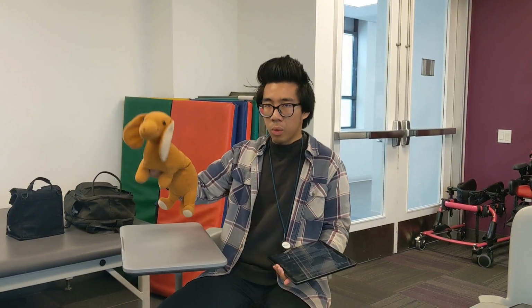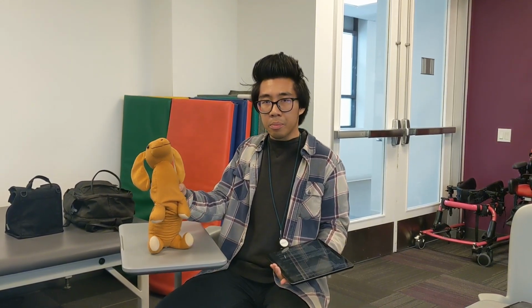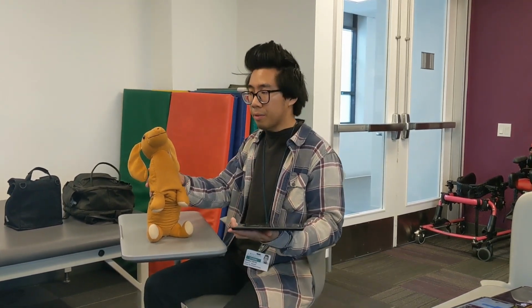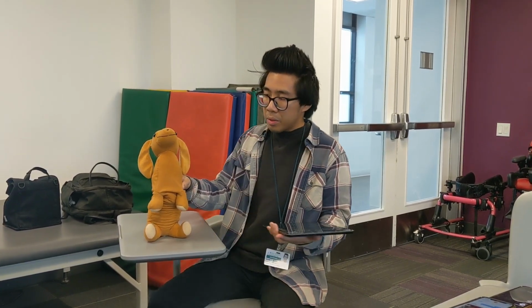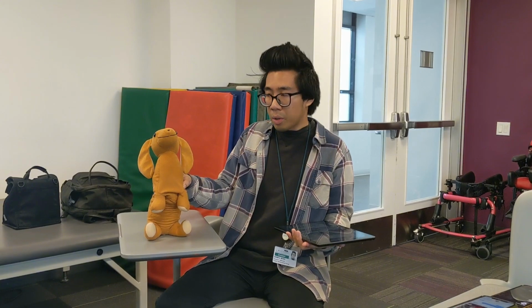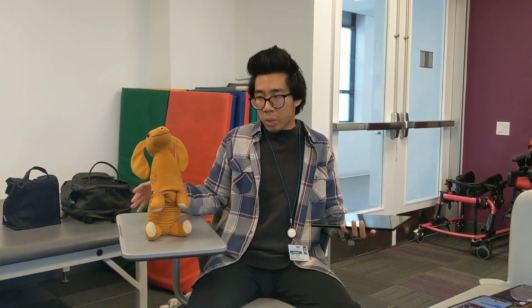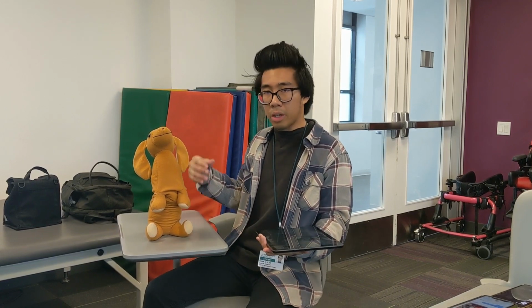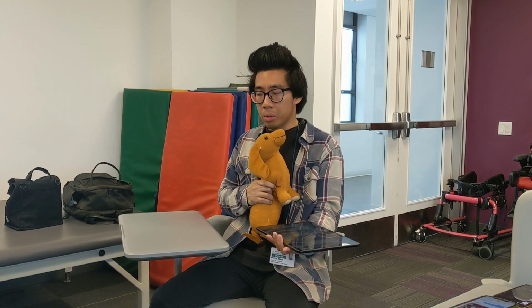This is a weighted toy. The primary purpose of this is to provide that proprioceptive input for children, which can modulate the central nervous system, inducing a calming effect on the child. It makes the child feel more grounded and it lowers their state of arousal. This can be used to improve their concentration, their focus, and their attention. Also, if they show any signs of distress, as we talked about with the precautions earlier, a child may use this to feel more grounded and lower their state of arousal.